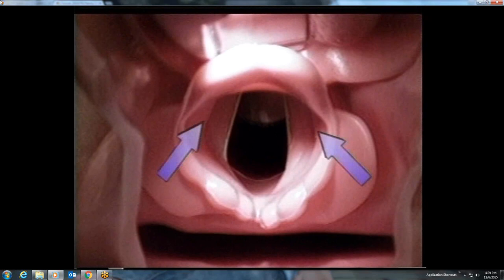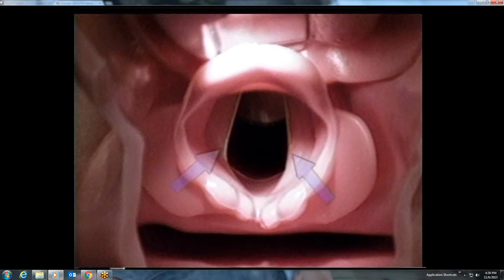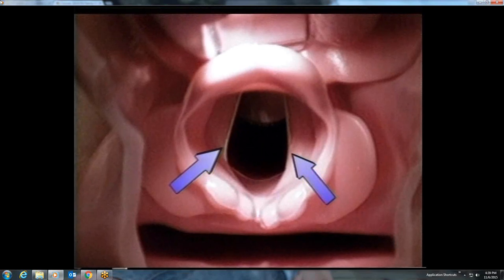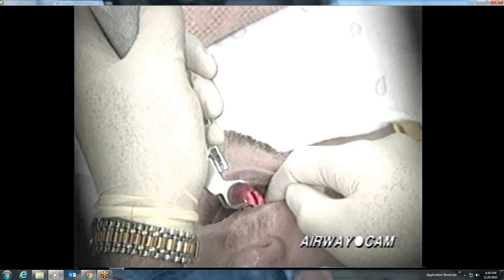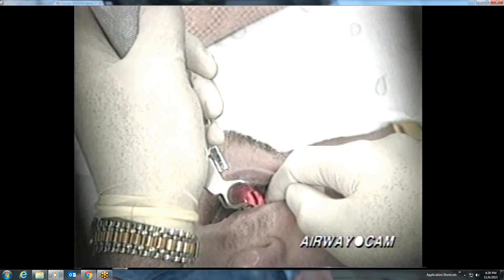Within the larynx, note the false vocal cords, also known as the vestibular folds. The true vocal cords, or vocal ligaments, are white and have a vertical orientation during direct laryngoscopy, which is exaggerated by traction on the laryngoscope blade. The glottic opening widens during inspiration. Depending on the muscular tone of the patient and the amount of traction on the laryngoscope, the glottic opening during laryngoscopy may be a small vertical slit or have a wide rhomboid shape.